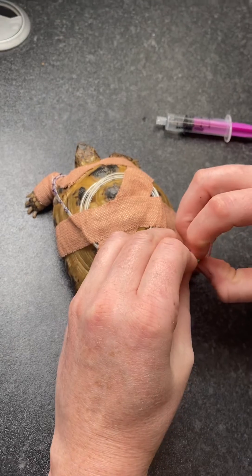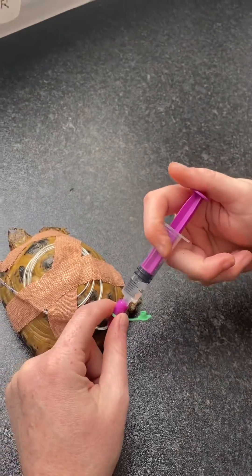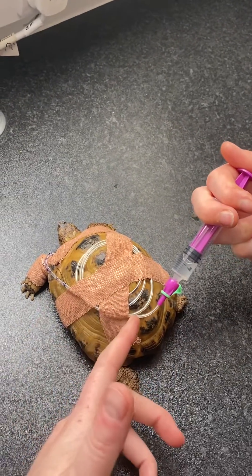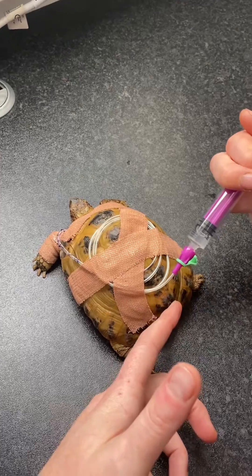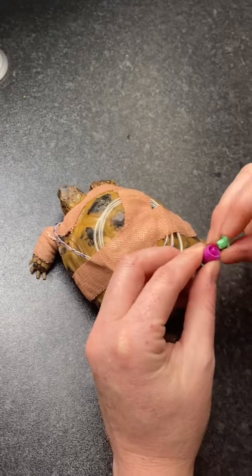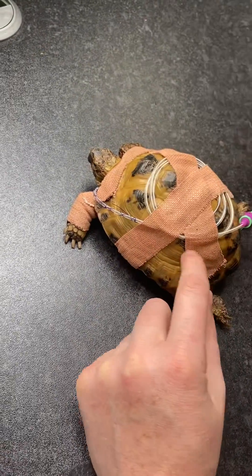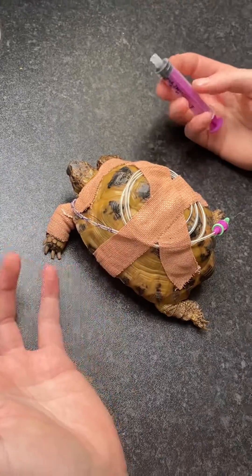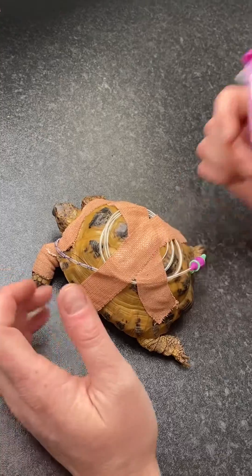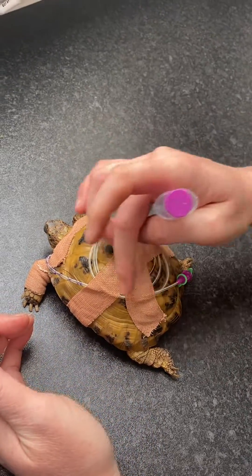When giving medications, it's really important to flush the tube before and after anything we're putting down there. In this instance, I'm just going to flush it with some water. We can see all these tiny little bubbles moving through with no resistance. Normally, if we were feeding or giving medications, we would flush, put the medications down the tube, and then flush a small amount of fluid afterwards to push those medications and food through the tube.